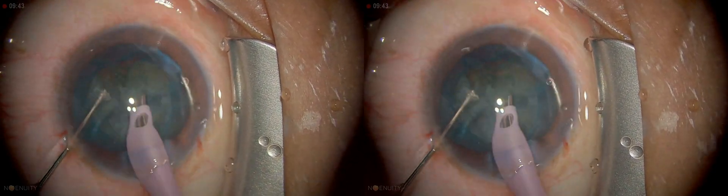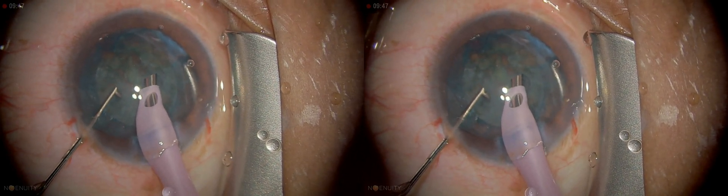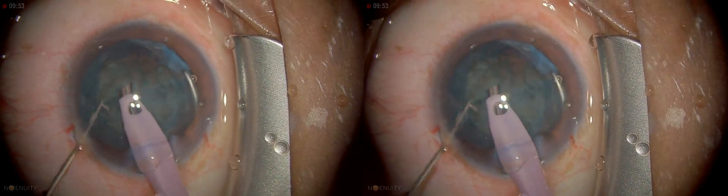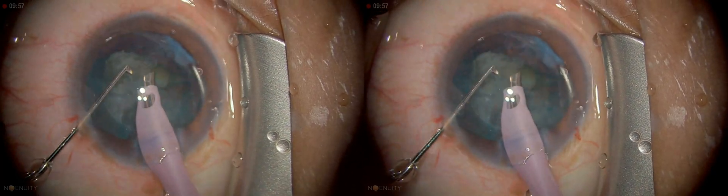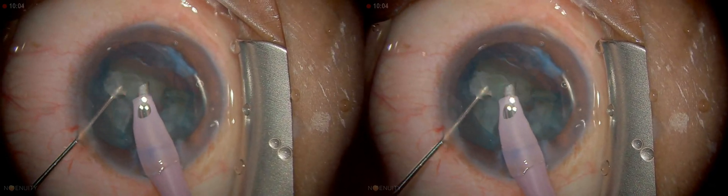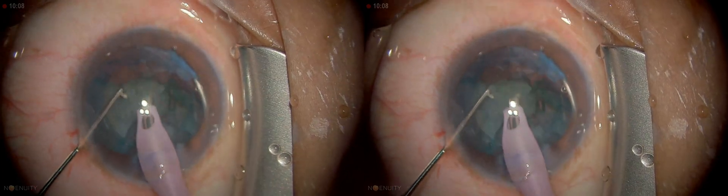We are in quadrant now, and the vacuum is more. I'm going to hold it, grasp it and pull it towards the center. Make sure when you tumble the quadrant not to allow it to touch the corneal endothelium — very important. I usually use the second instrument above the quadrant to make sure it doesn't come up and hit the endothelium.